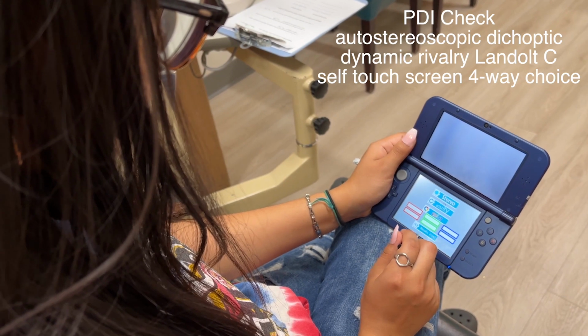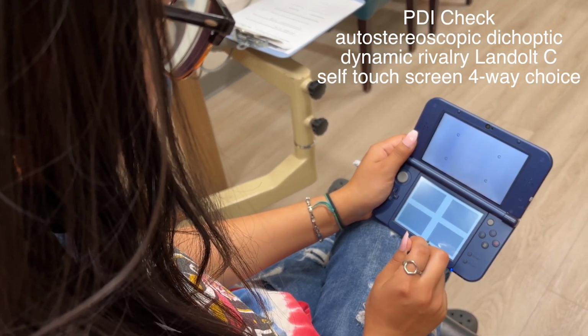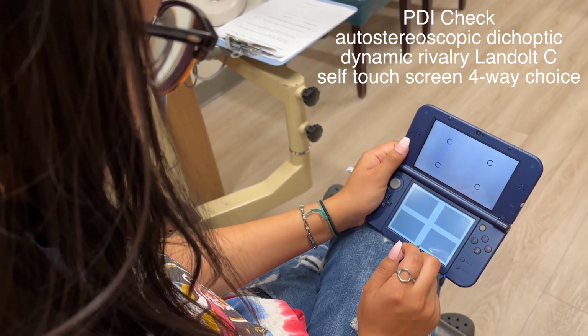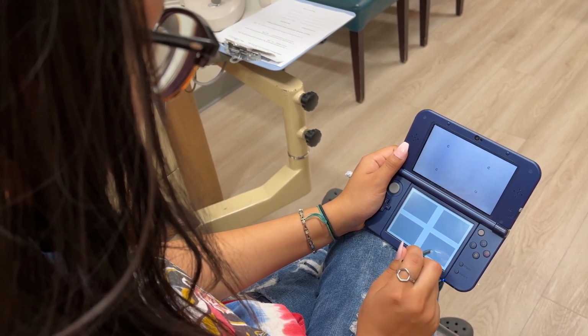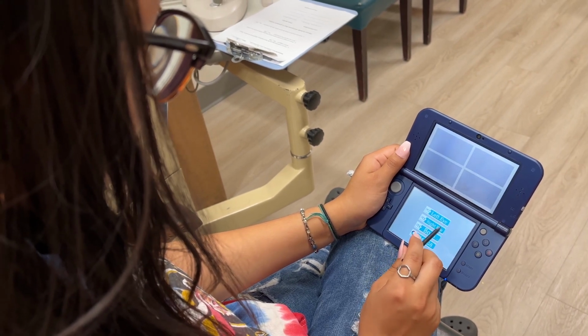Next one, click Acuity next. And find one that looks different. One of them will look different than the others. Kind of at the top, it'll look different. Perfect. Now, see if one looks different. Perfect. Now click Color. Left eye.